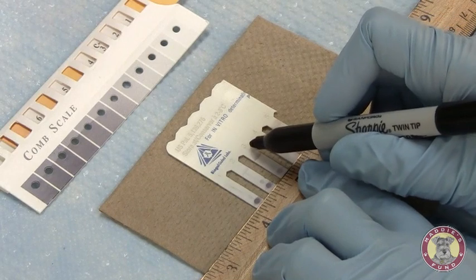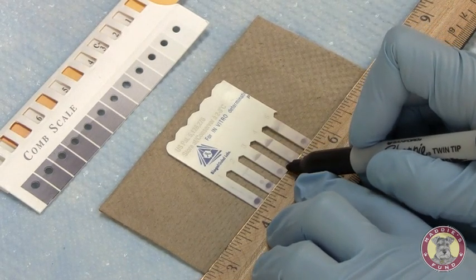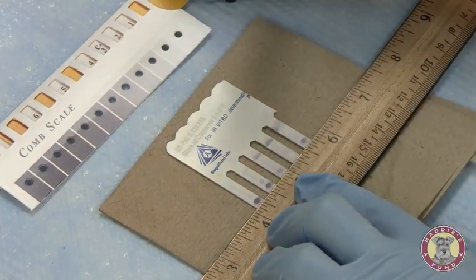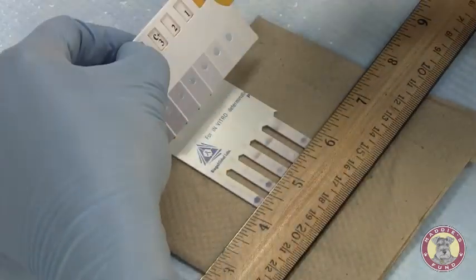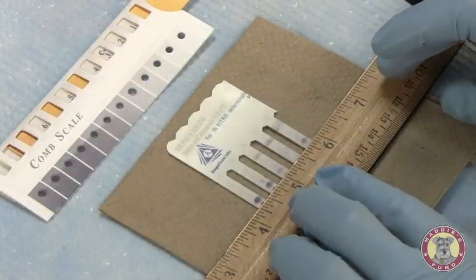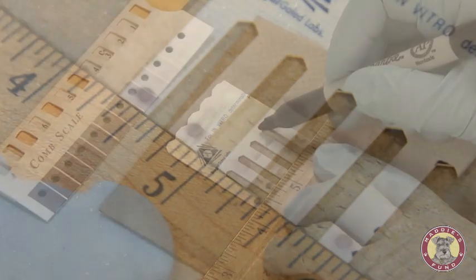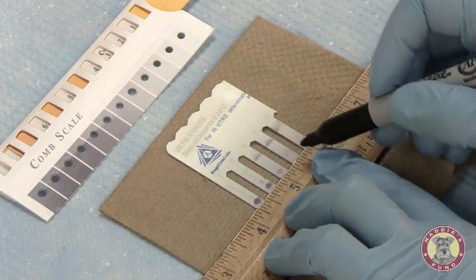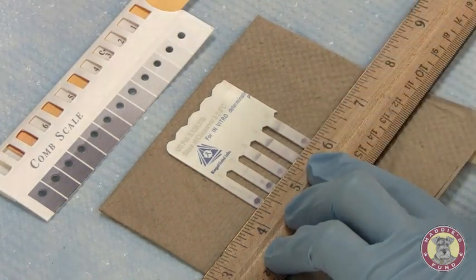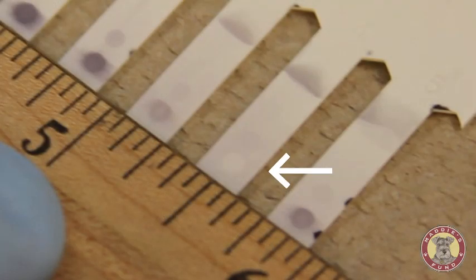Moving down, sample 3 — the color development is slightly darker than my positive control, which I have marked as a 3. I'll gauge that as a 4. Sample 4, you can see there's a white circle. There's no color development that has taken place.